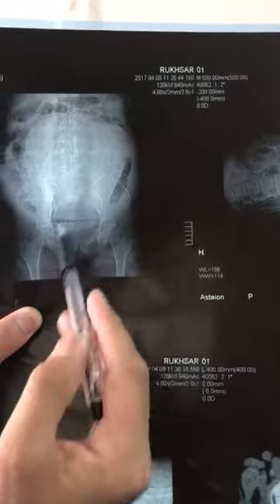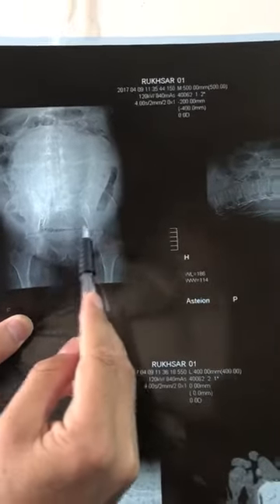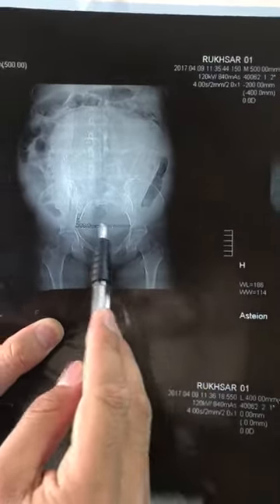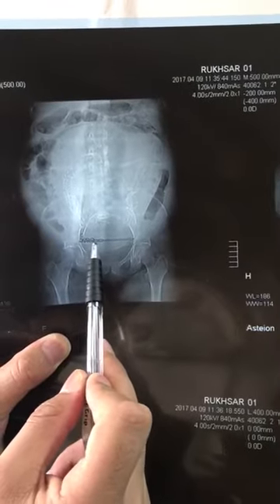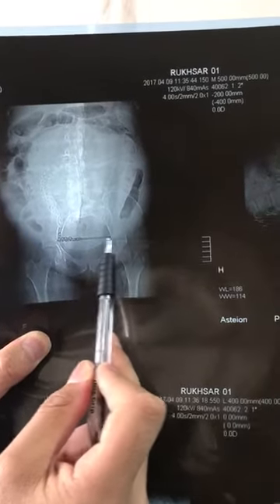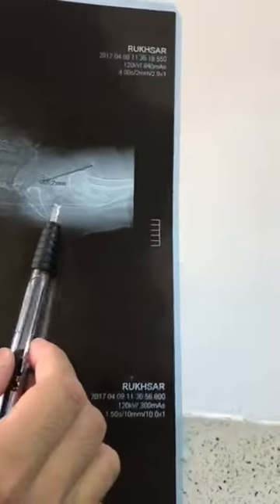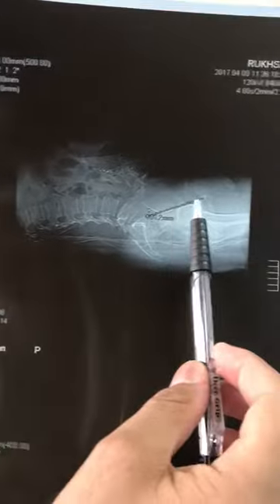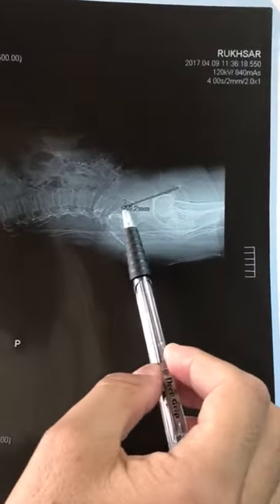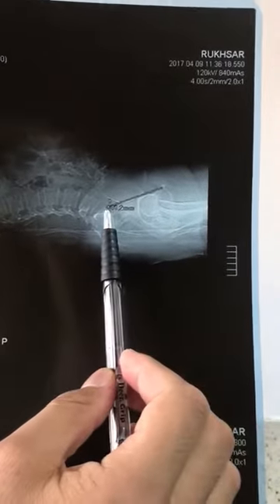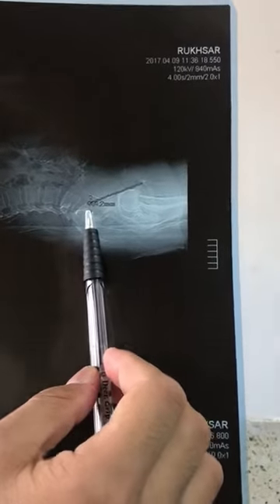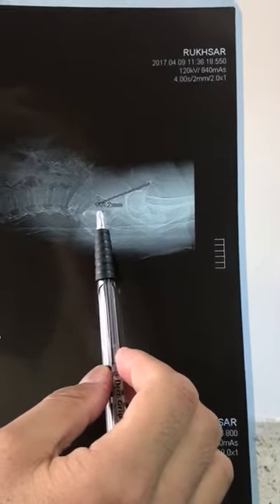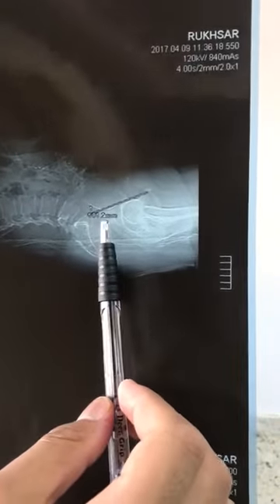This is the head of the fetus, and the transverse diameter of the pelvic inlet is 10.8 cm in this CT scan. This is the lateral view in which we look for the anterior-posterior diameter of the pelvic inlet between the symphysis pubis and the promontory of the sacrum. This is 10.1 cm in this CT pelvimetry.